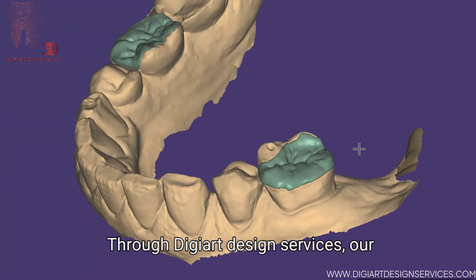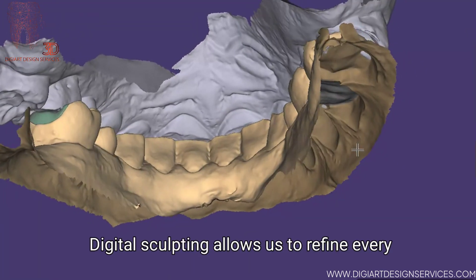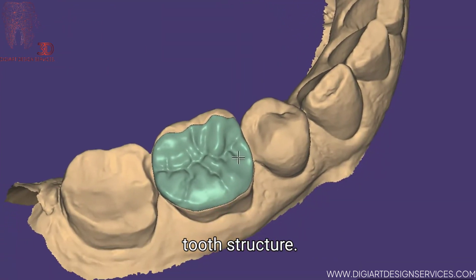Through DigiArt Design Services, our craftsmanship reaches new heights. Digital sculpting allows us to refine every contour, optimising strength while preserving tooth structure.